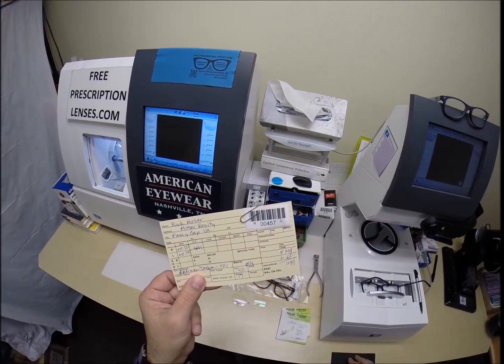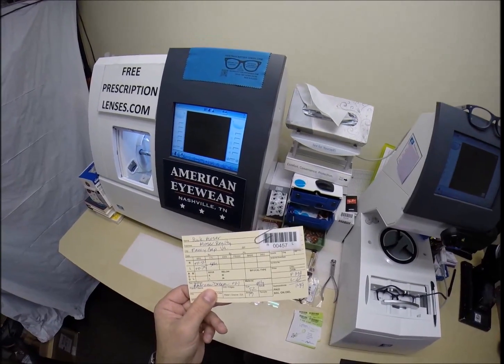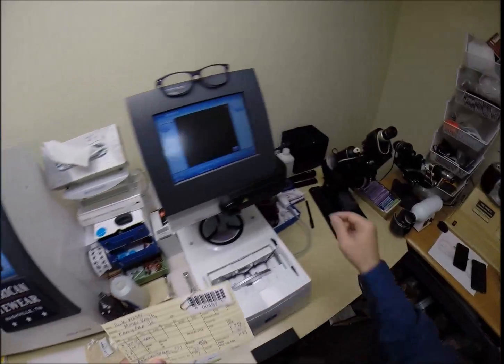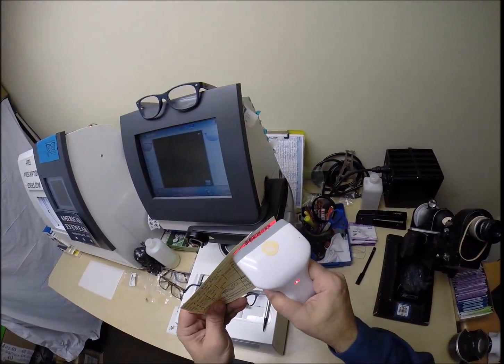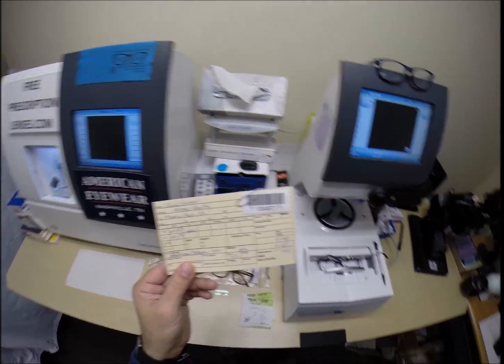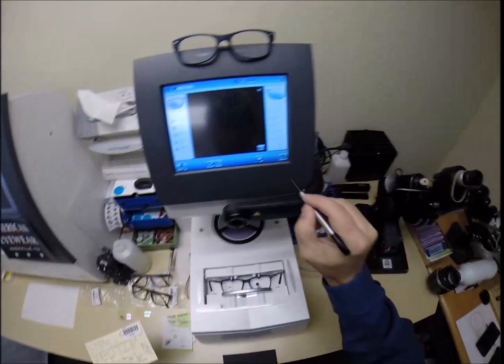This is the 457th volume of my 250 million part series of making a pair of glasses for everyone in America. You will be barcoded into my computer, so should you ever need new lenses for this frame, I can cut them, and normally I would mail them to people, but I will deliver these to you. 457. So now I can hit start.